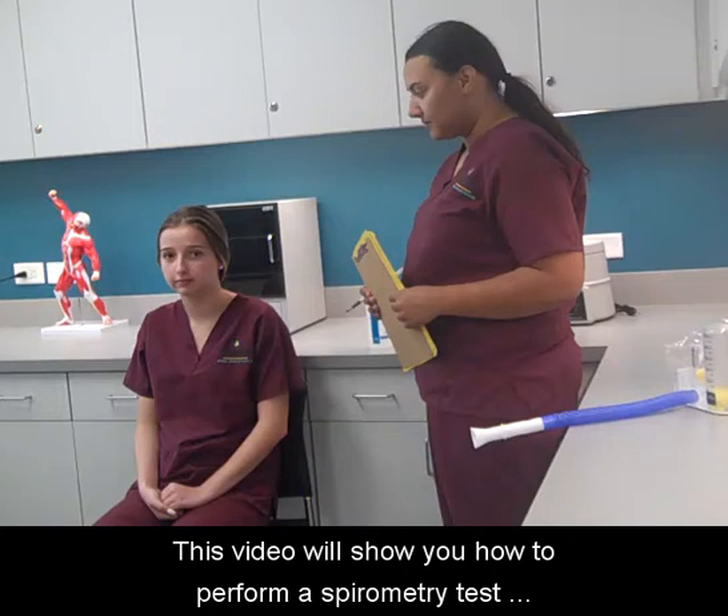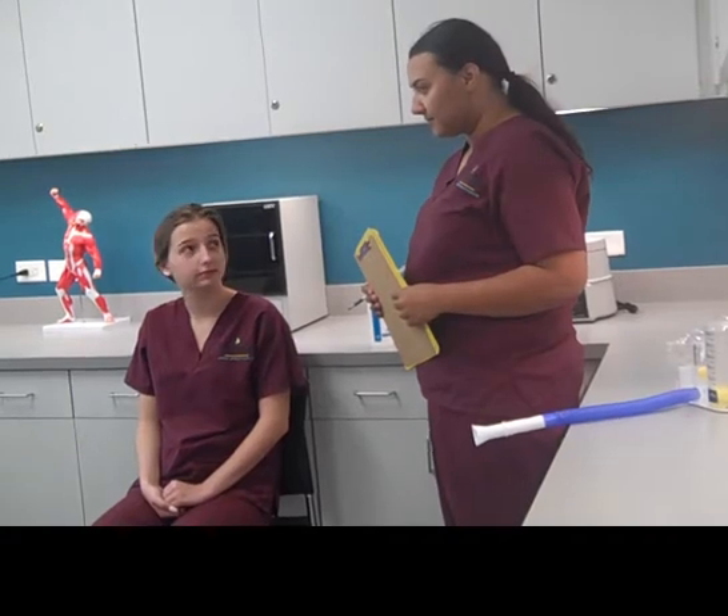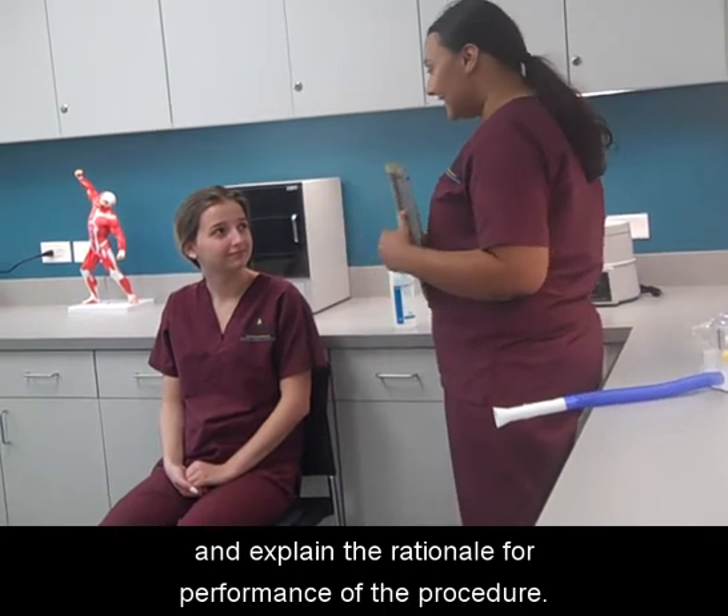This video will show you how to perform a spirometry test to measure forced vital capacity. Identify the patient, introduce yourself, and explain the rationale for performance of the procedure.